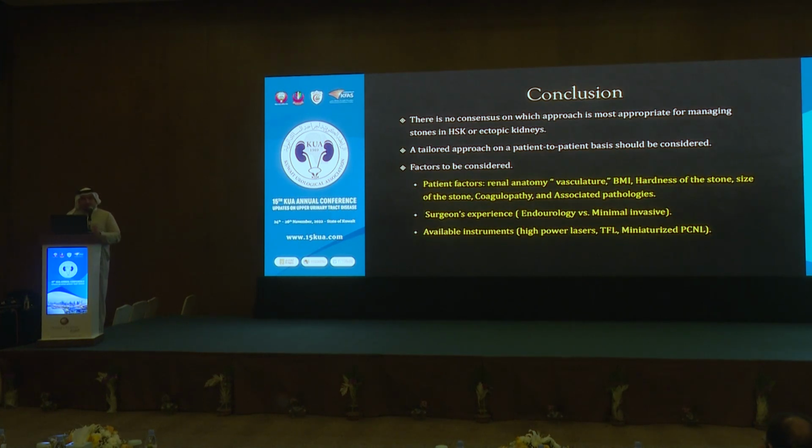In conclusion, there is no consensus on which approach is the most appropriate for managing stones in horseshoe kidney or ectopic kidney. A tailored approach on a patient-to-patient basis should be considered. Factors to be considered: patient factors, renal anatomy, vasculature, body mass index, hardness of the stone, size of the stone, coagulopathy and associated pathologies, surgeon's experience in endourology versus minimally invasive, and available instruments if you have a high-power laser or TFL or miniaturized PCNL.